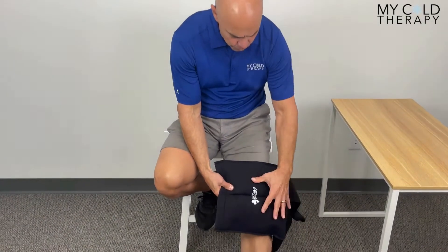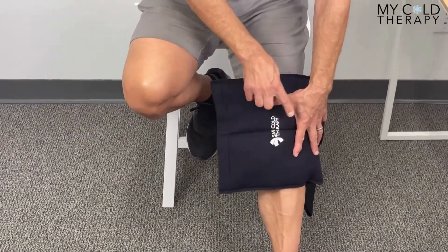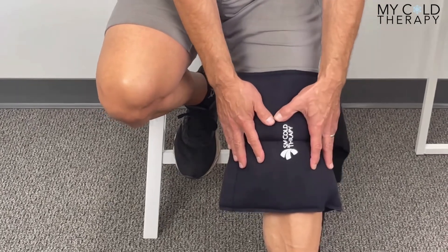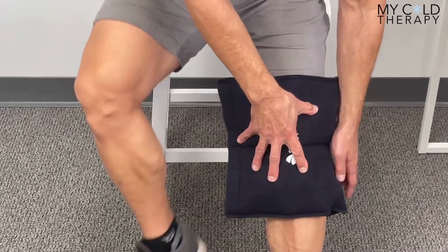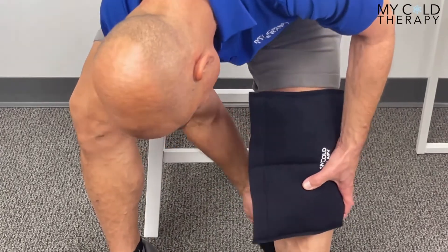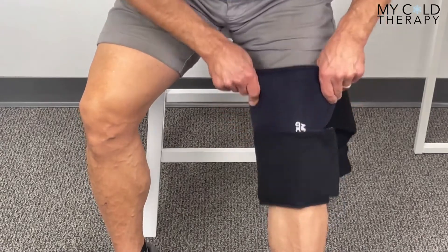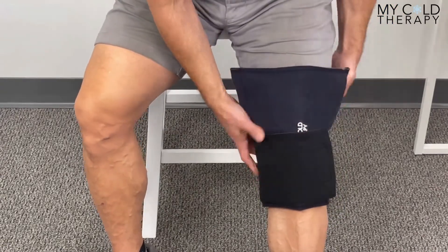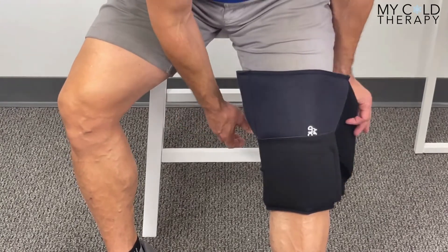As you put this on, you want the SMI logo to be oriented up and down — it should not be going left to right — and you want to get this in the middle of your kneecap. That way you'll get the best coverage. I usually take the bottom strap, get it tight and into position, then take the top strap and get that into position as well.